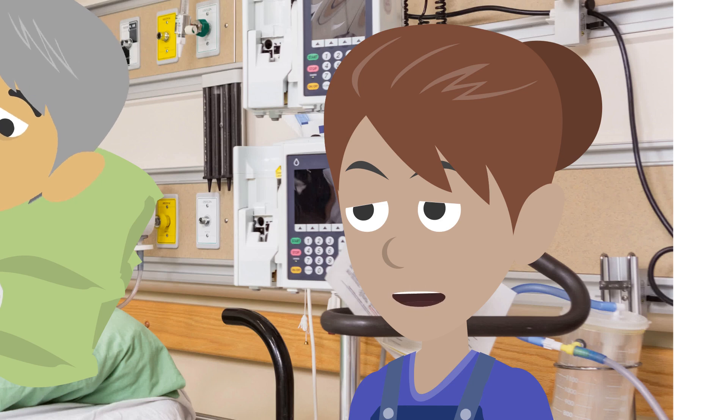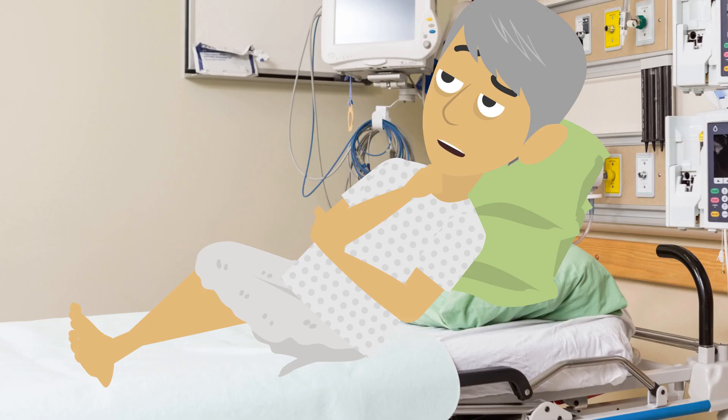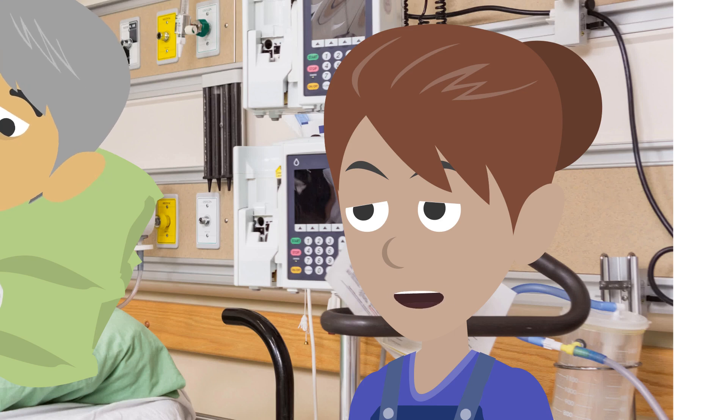I'll just put the used equipment, apron and gloves in the clinical waste bin and sanitize my hands. Then I'll make sure you are comfortable. Thank you. You should also be aware that a further pH check will be done before your first feed, and you may also need an x-ray to confirm the position of the tube if there is any doubt about the correct placement.